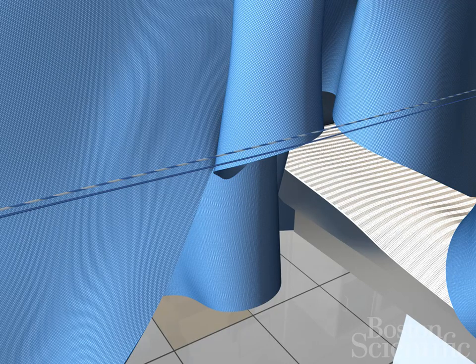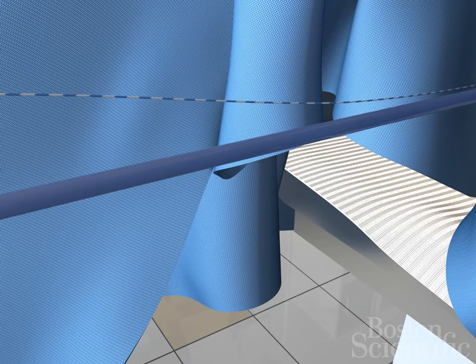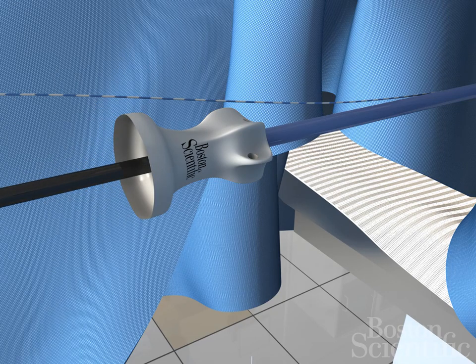Advance a ureteral access sheath over the working wire. Remove the working wire. Remove the core of the access sheath, leaving in the outer sheath. Leave the safety wire in place in the ureter. Insert the flexible ureteroscope through the access sheath.